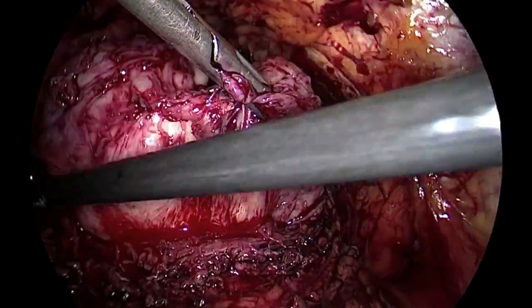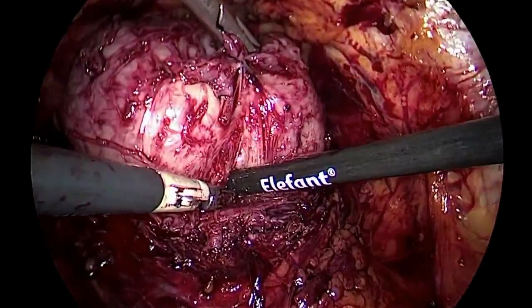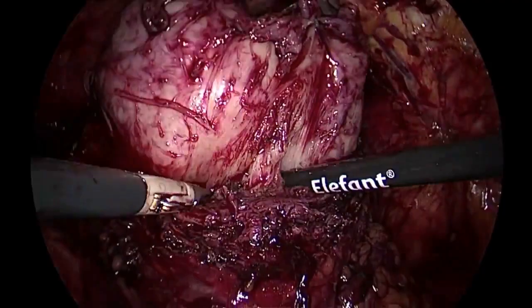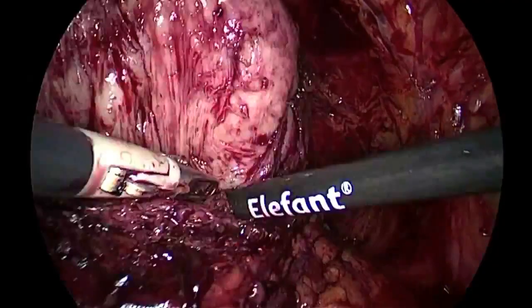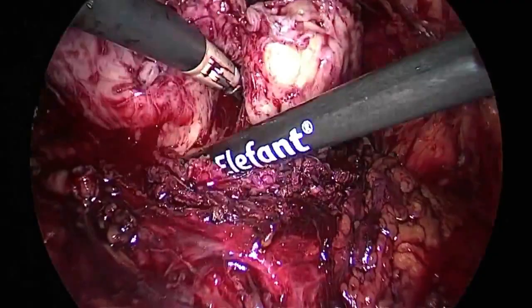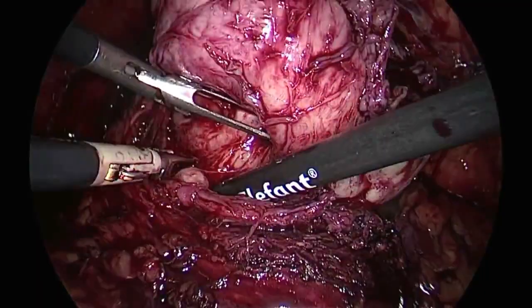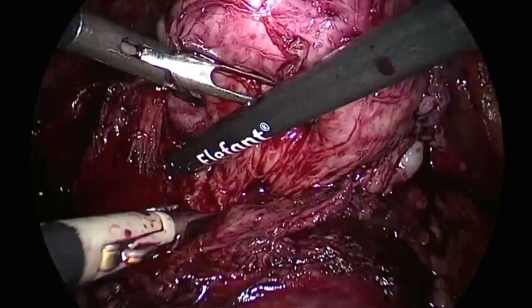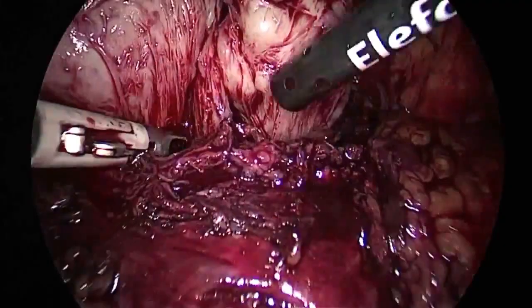The advantages of this technique are the following: for a big adenoma, for a large adenoma, obviously, it is good. I think it's better, in my opinion, especially in terms of irritative symptoms, to perform this kind of enucleation in comparison with the other technique. Obviously I have no experience with holmium laser, but the energy that we use is confined only to the bipolar energy. So I think that you reduce significantly the energy at the level of the capsula. And so I think that we have advantages in terms of irritative symptoms, and this is one topic that we need to take into consideration.